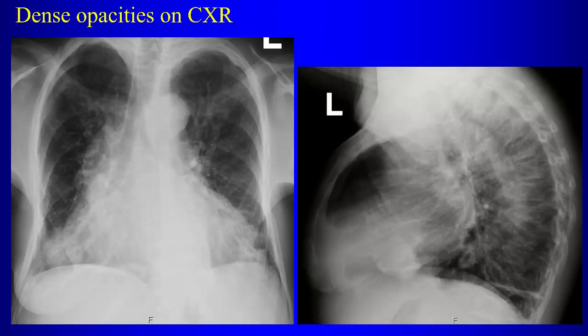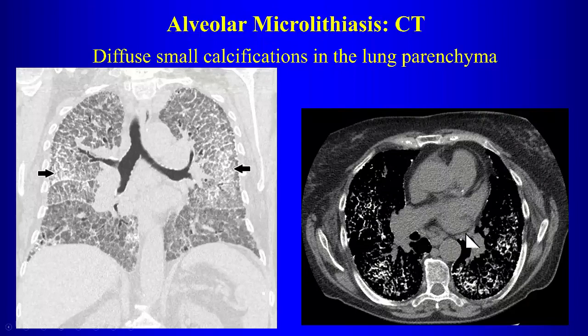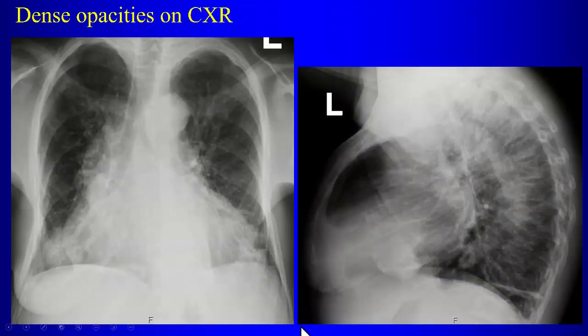If we get that case on a non-contrast CT of the chest, would you recommend contrast after to look at the mediastinum or not? No, you don't need contrast. Why would you want to look at the mediastinum? Notes, like lymph nodes. Well, usually CT is good enough to look for lymph nodes even on a non-contrast CT, right? And it's not going to matter that much if the nodes are small.